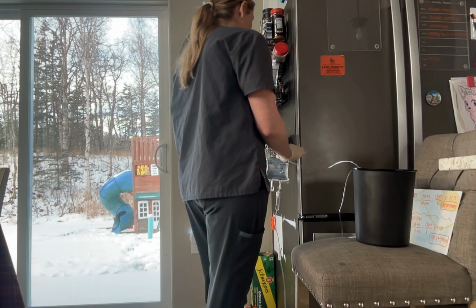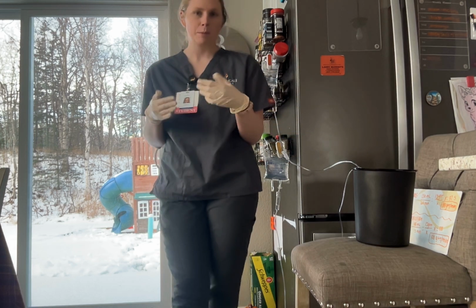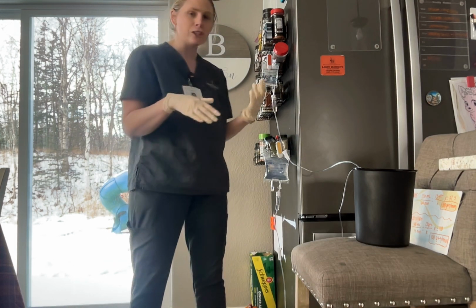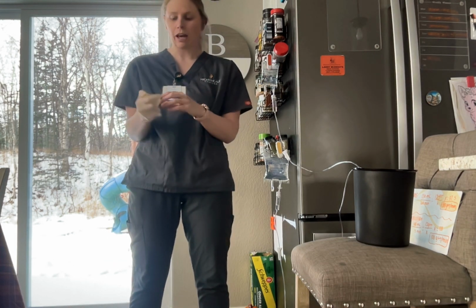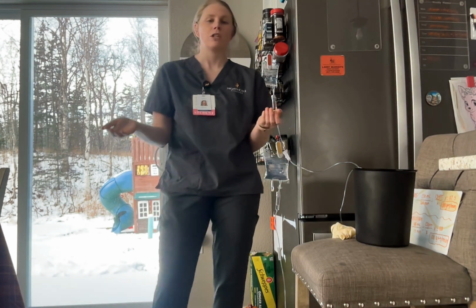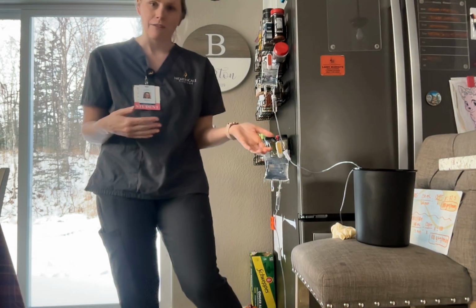Okay, now the patient is receiving the amoxicillin at 100 drops per minute for the next 15 minutes. So we're going to ensure that the patient is comfortable. We're going to remove our gloves, wash our hands, and then leave the room to document that we just gave them the fluids and the medication through the IV.